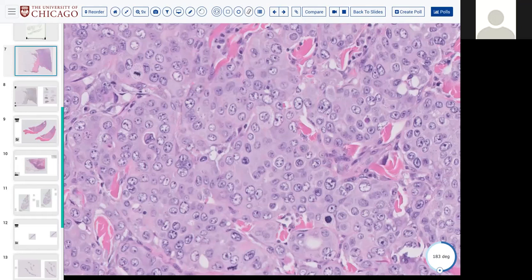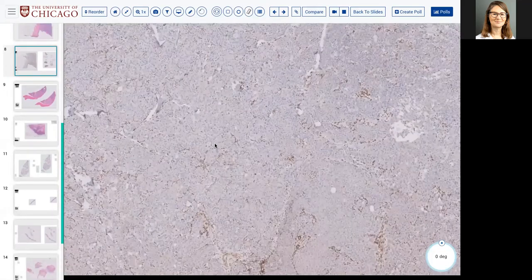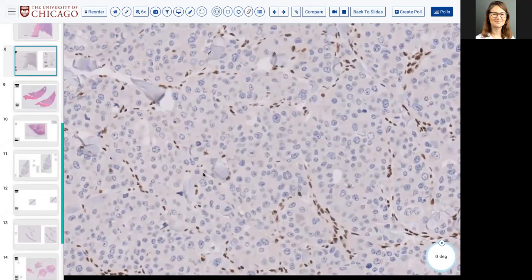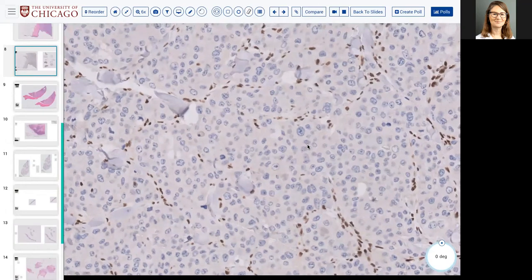So keratin positive mesenchymal, quote unquote, neoplasms are highly common. Okay, don't forget that. So this tumor is ragingly keratin positive, and devastatingly INI1 negative. All right, so here's your INI1. Then you have to take into consideration, okay, this is a keratin positive INI1 lost lesion. Where is it located? Okay, because this might be a matter of semantics.